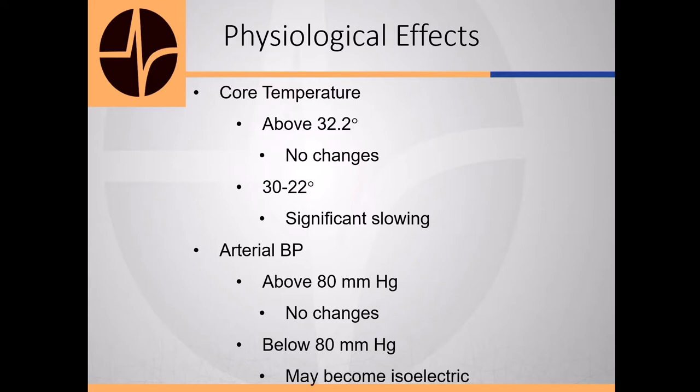So we've all been in there where the surgeon says, I've got the patient bleeding, lower the blood pressure, and the anesthesiologist takes them from 80 down to 70 MAP. You're going to have a hard time getting the MEPs. You're going to have a hard time getting your cortical SSEPs because your EEG has slowed. So it's another nice reason just to run EEG during spine cases.